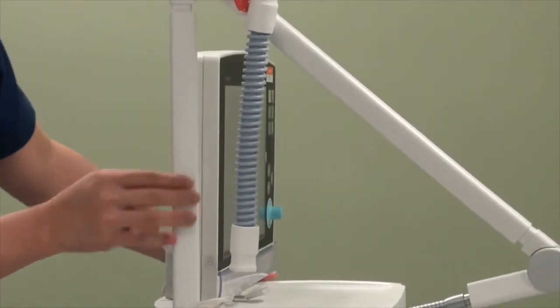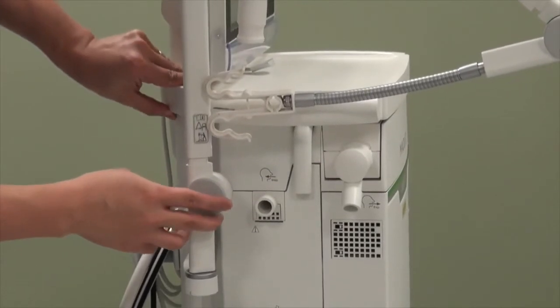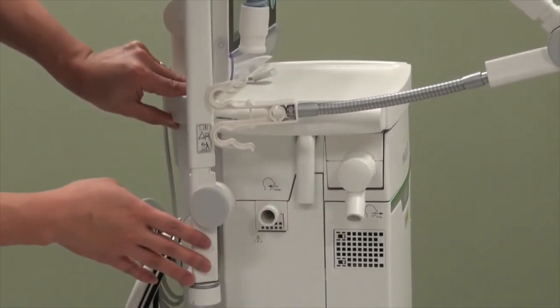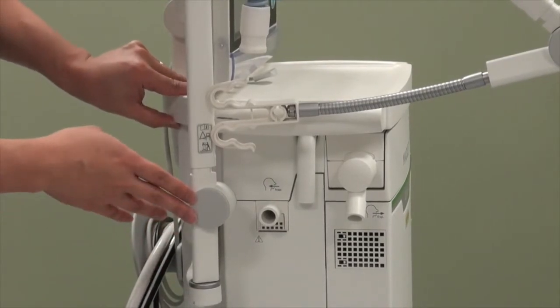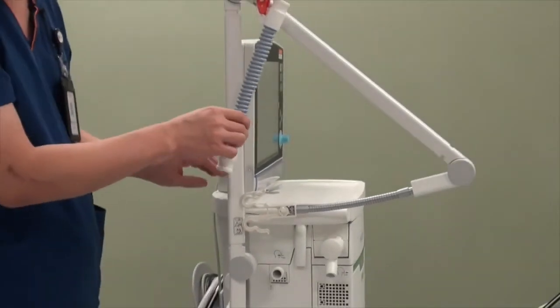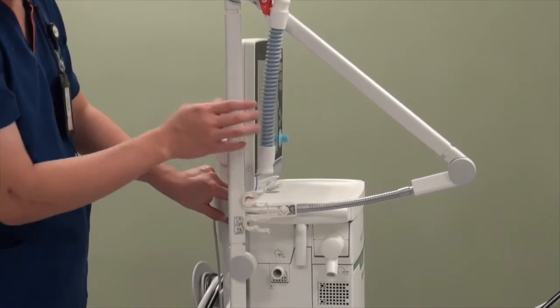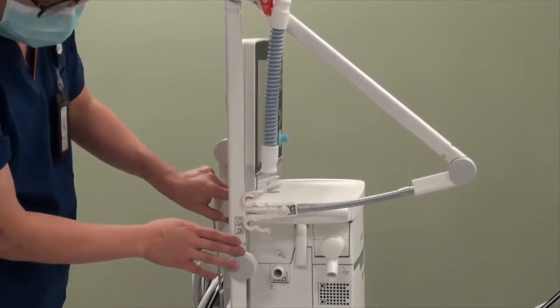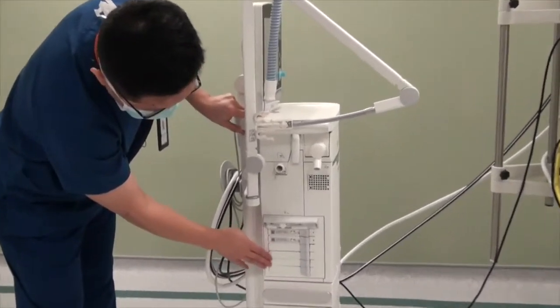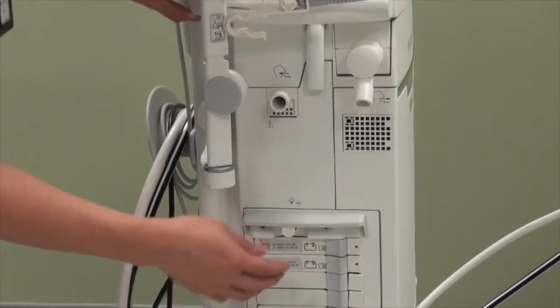On this side is where the inspiratory inlet and the expiratory exhaust is — this is where we connect the inspiratory and expiratory limb of the patient circuit. Hooked to the top is a gas tubing needed for the pre-setup test. At the bottom, we have several modules where we can add features to the ventilator as well as extra batteries.